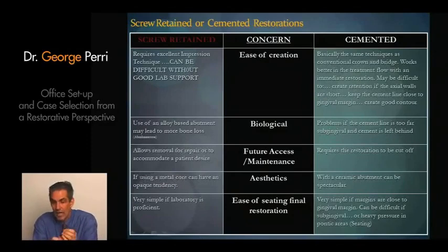but I'd like to say that sometimes there are easier ways to do it. I think a cemented crown works better in the flow with immediate restorations, and that's related to the fact that the implants quite often have a slight labial inclination that precludes a direct screw retained restoration. So I expect on an immediate restoration that we're going to do some sort of cemented crown, and that's just what follows.